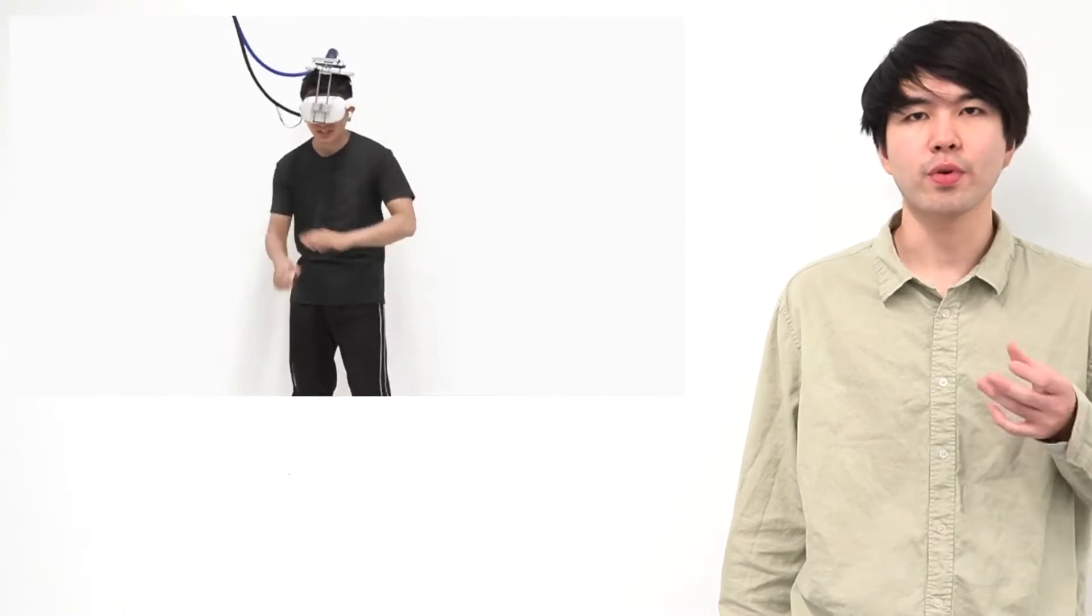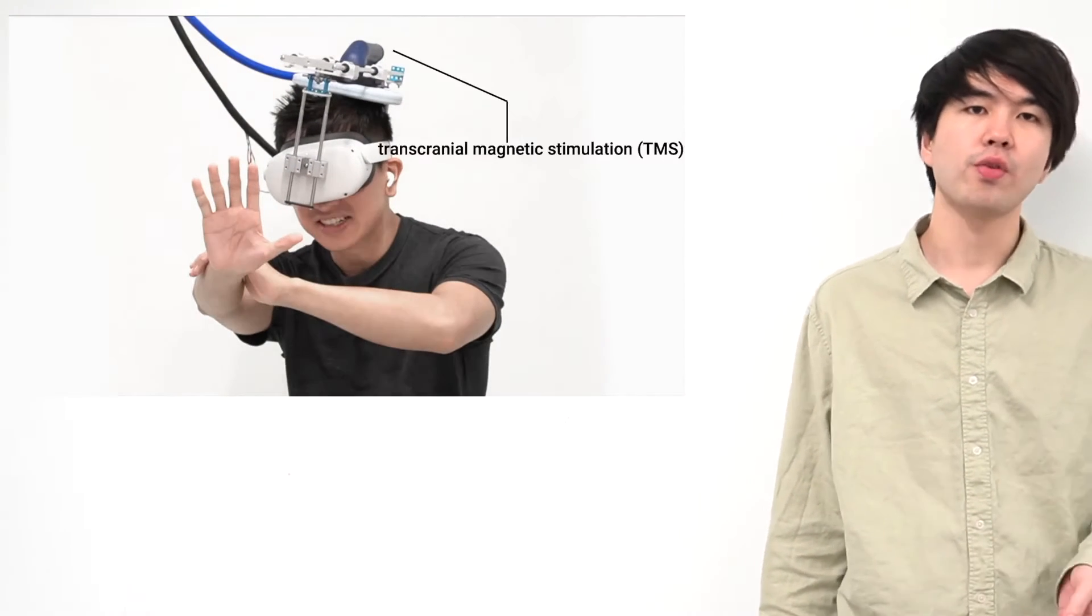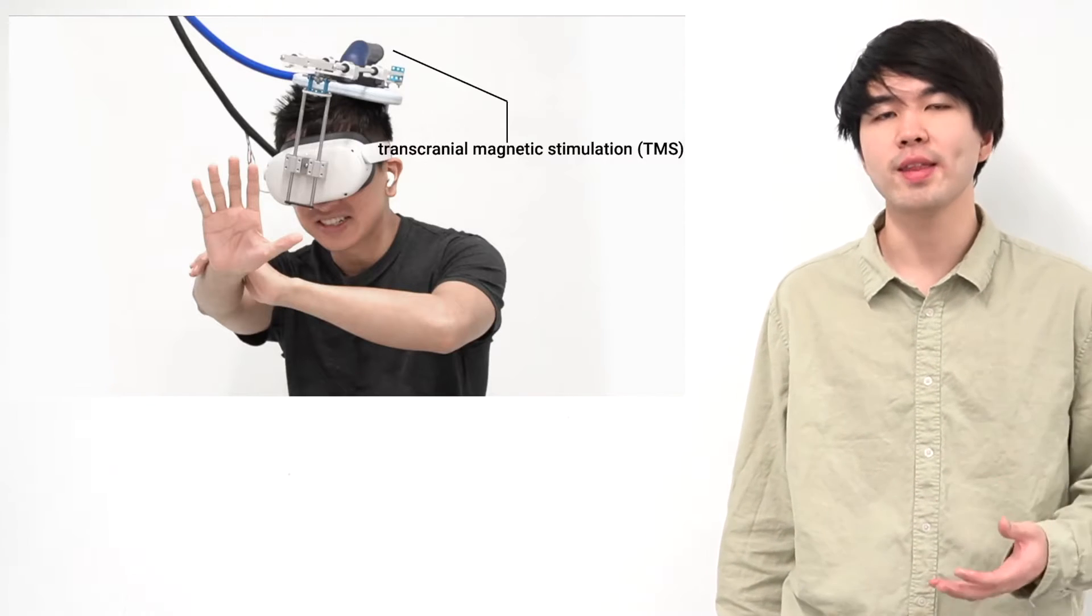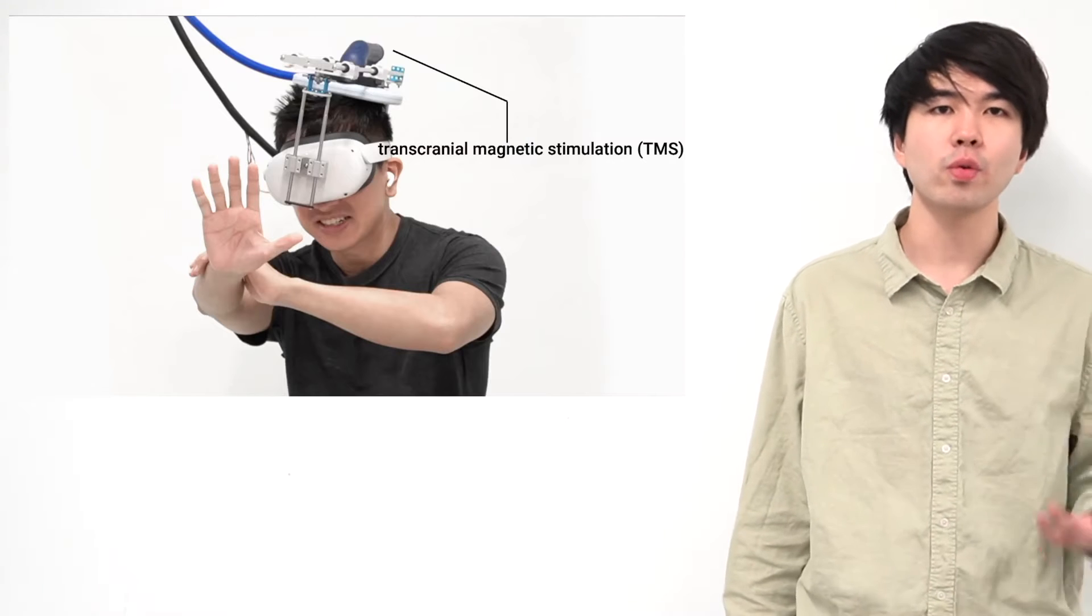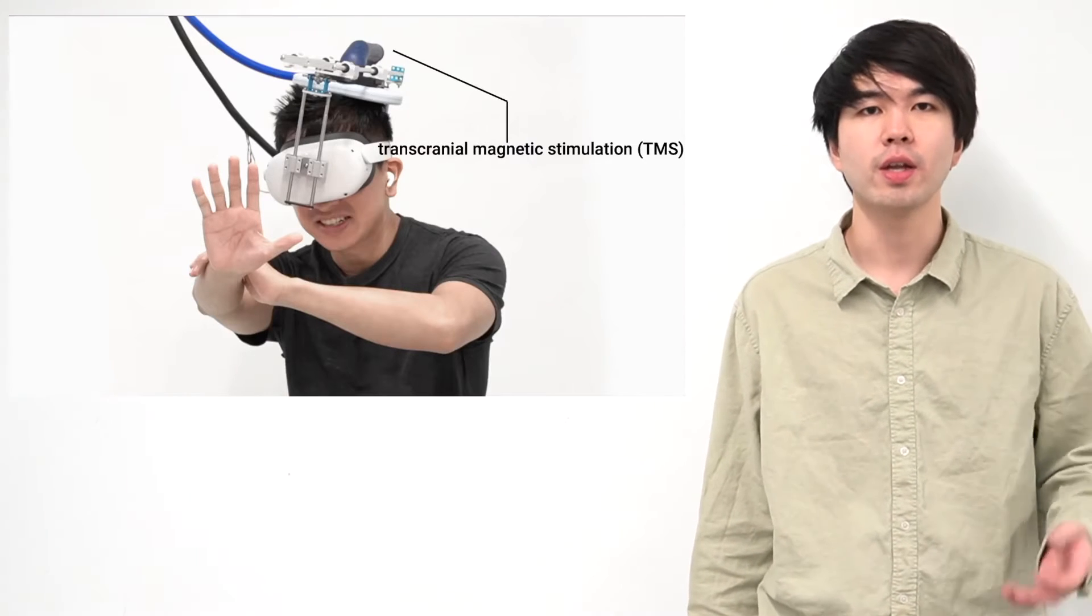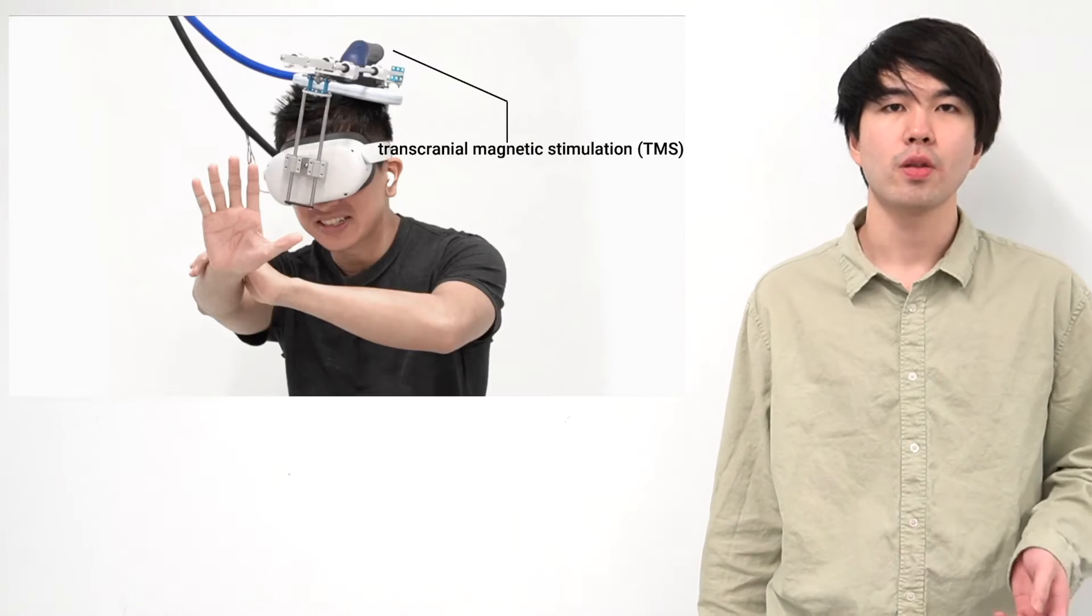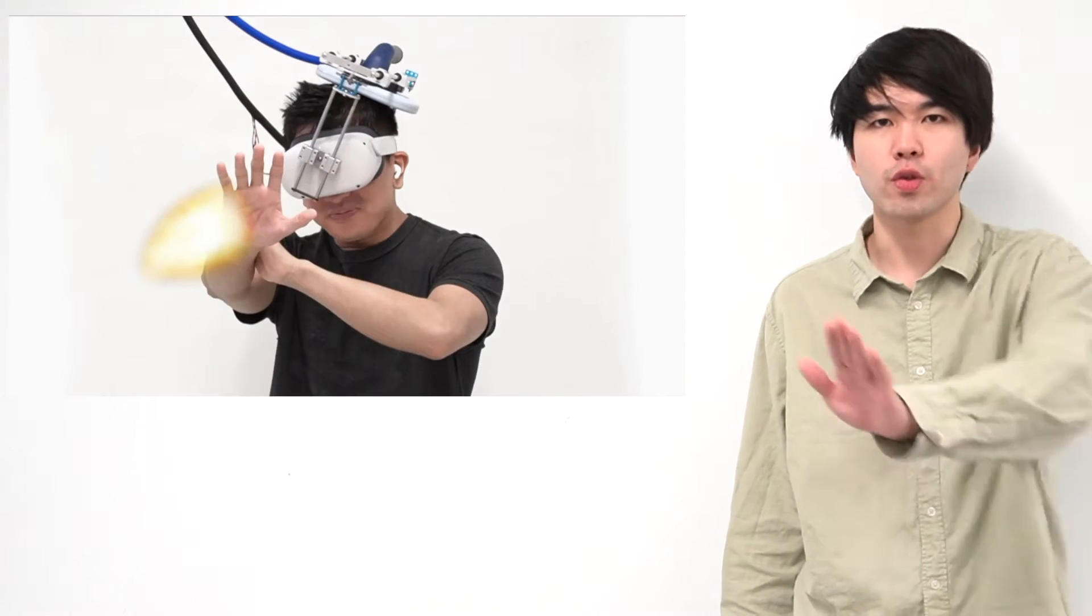So let's get back to our original demo. Whoa, turned out what this person wears is our brain stimulation device that leverages transcranial magnetic stimulation, which is a non-invasive brain stimulation technique established in neuroscience using an electromagnetic coil energized by a stimulator that is currently off the screen. So at this right moment, when the user should feel the recoil of shooting a projectile, this coil creates a magnetic field that stimulates a corresponding brain area, creating touch and force feedback in their hand.